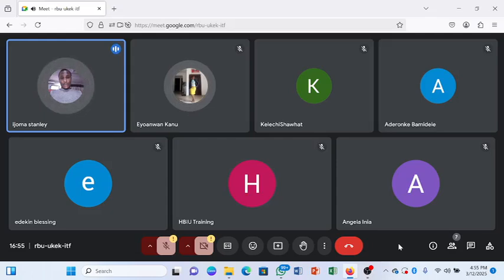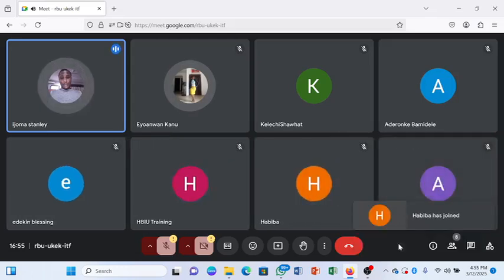So what I'm trying to say in essence here is that the cap has a combination of a red and a gray coloring. I think we mentioned a serum separator bottle. This is actually the bottle whereby when you take a blood sample in it, the blood stays down while the serum will stay up, to avoid contamination of the serum, so that they don't mix up. So this is actually the special bottle for it.